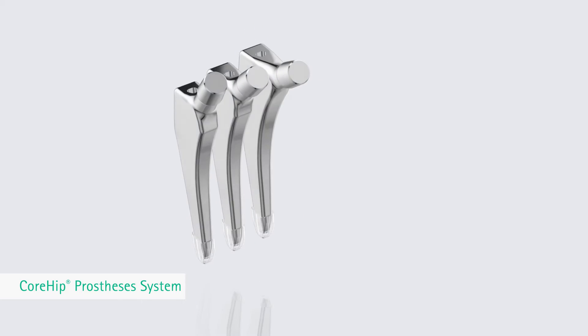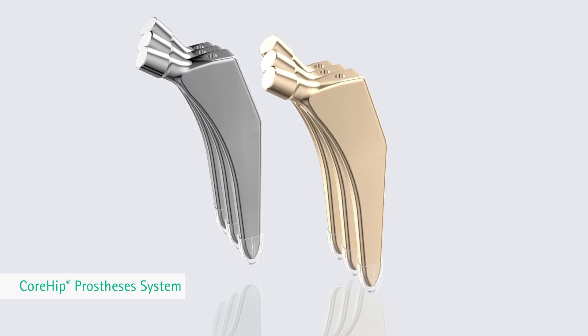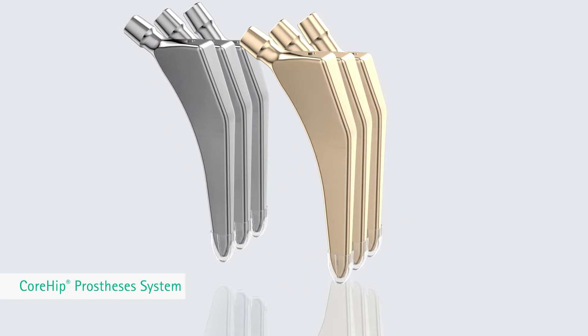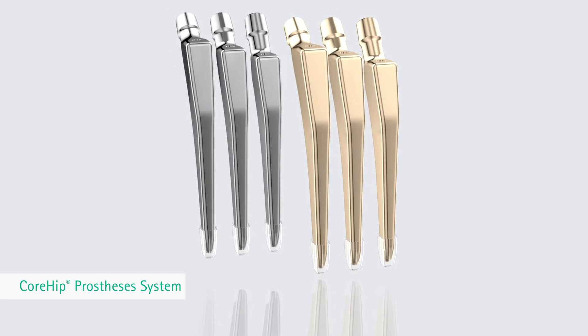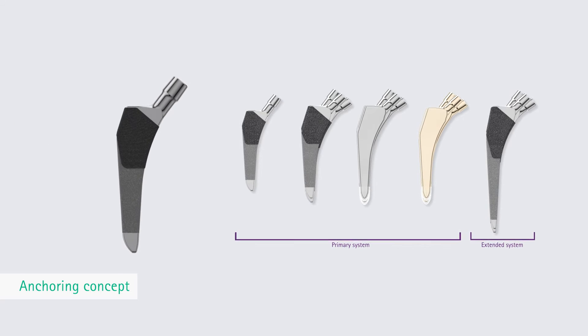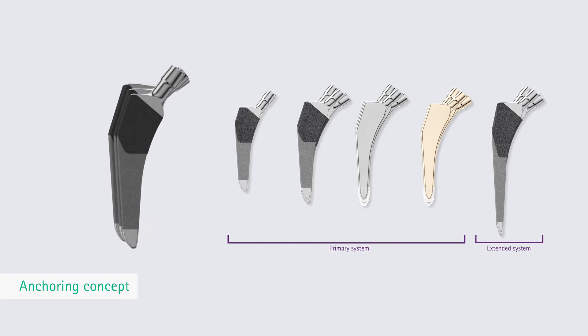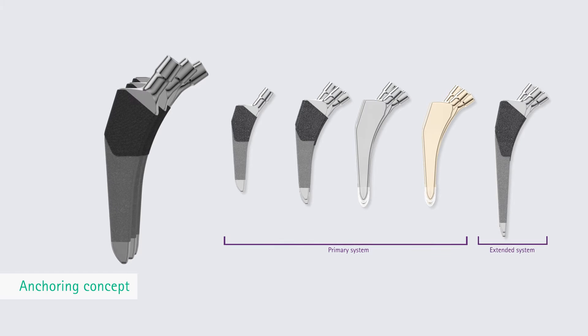Even with the cemented Core Hip version, the cemented stems are made of a cobalt-chromium forging alloy, while the Core Hip AS version stems are coated with a multi-layer system of chromium nitride, chromium carbo-nitride, and zirconium nitride. The Core Hip stem series separates stem anchorage and reconstruction of the joint center, enabling independent and separate realization of individual offset and leg length.